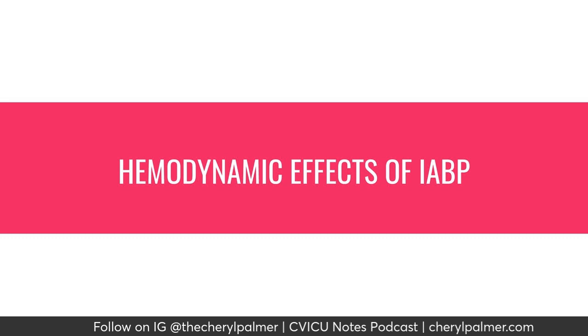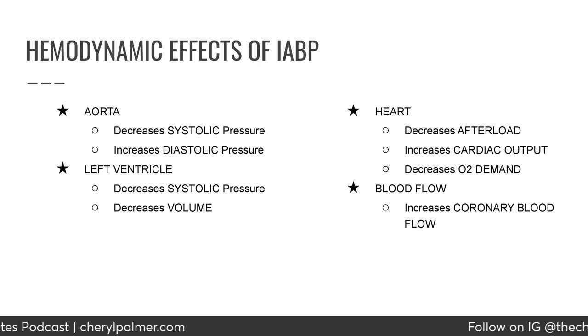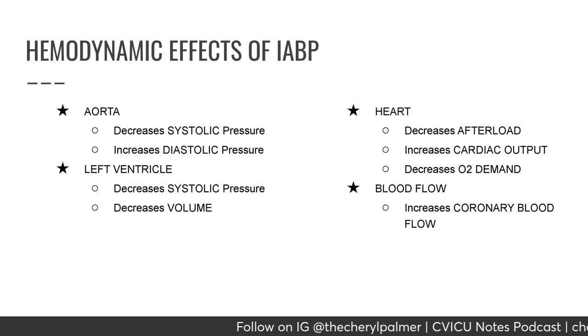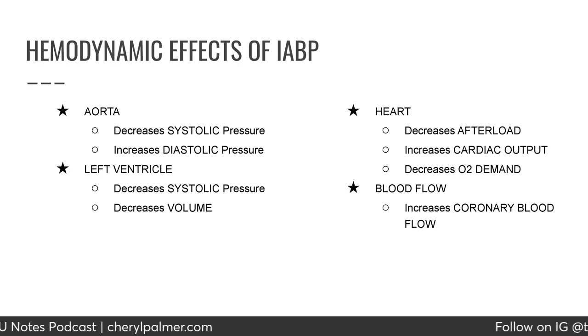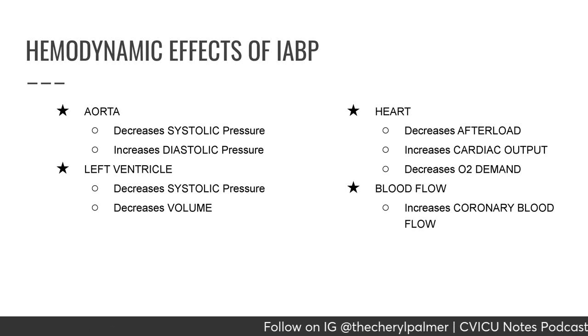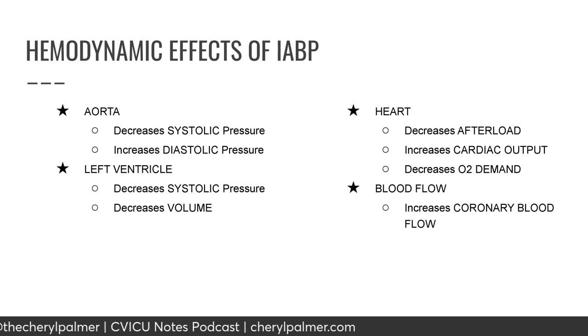Hemodynamic effects of the balloon pump. For the aorta, it decreases systolic pressure and increases diastolic pressure. For the left ventricle, it decreases systolic pressure and decreases volume. For the heart, it decreases afterload, increases cardiac output, and decreases oxygen demand. For blood flow, it increases coronary artery blood flow.